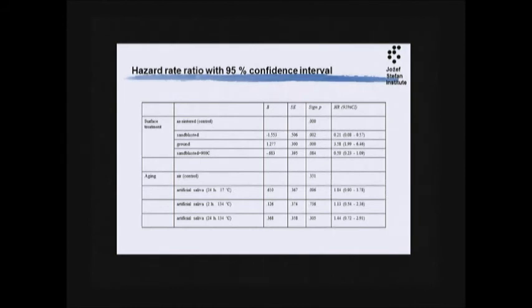And if we check the influence of the medium, I mean saliva, 24 hours body temperature, autoclave 2 hours, autoclave 24 hours, we see the hazard rate for a failure will be larger than the controls, which means almost 2 times higher chance for a premature failure.